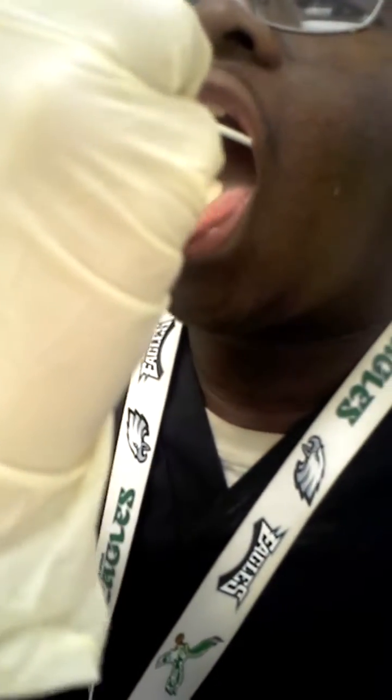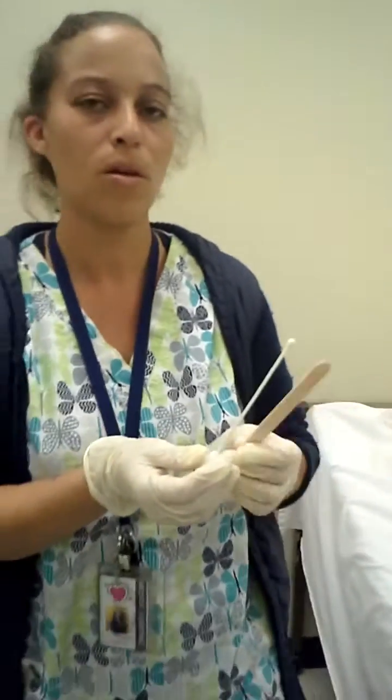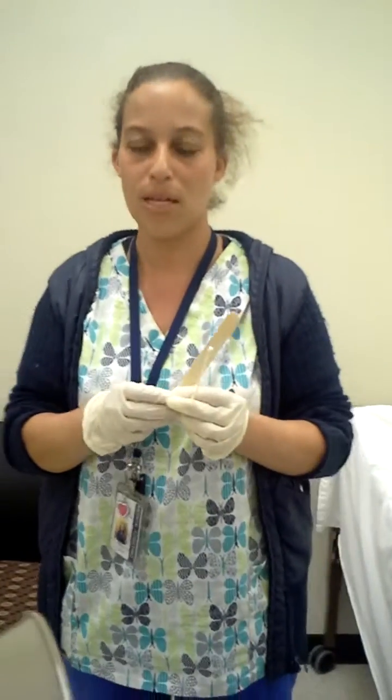Sir, will you please open up your mouth, say 'I,' stick out your tongue. We're going to go in the posterior of the walls of the throat. Make sure you don't hit the uvula to avoid gag reflexes.